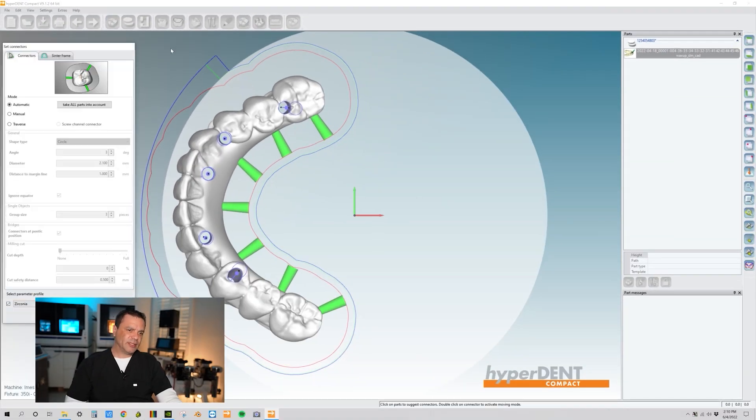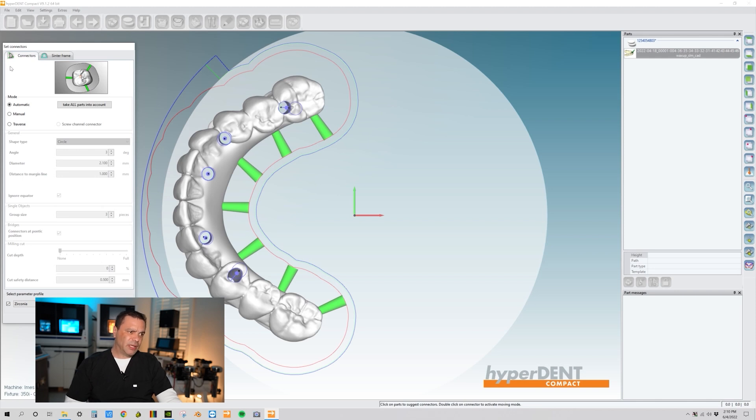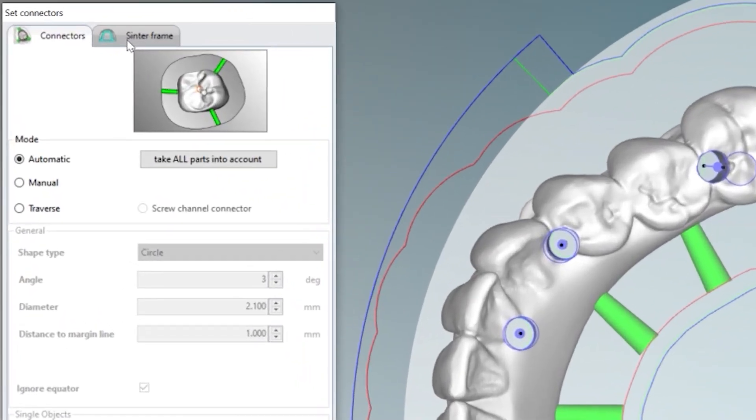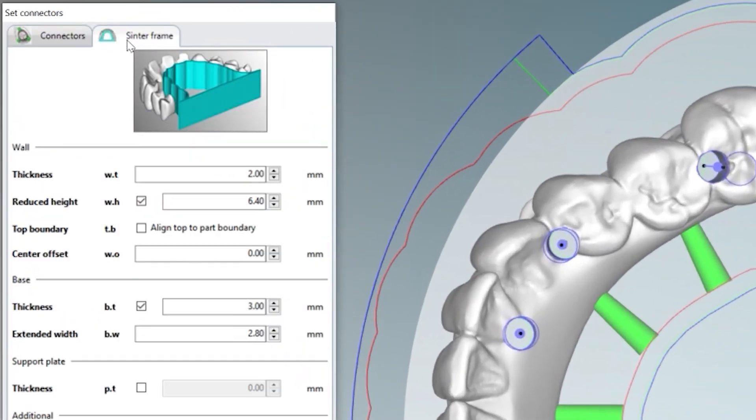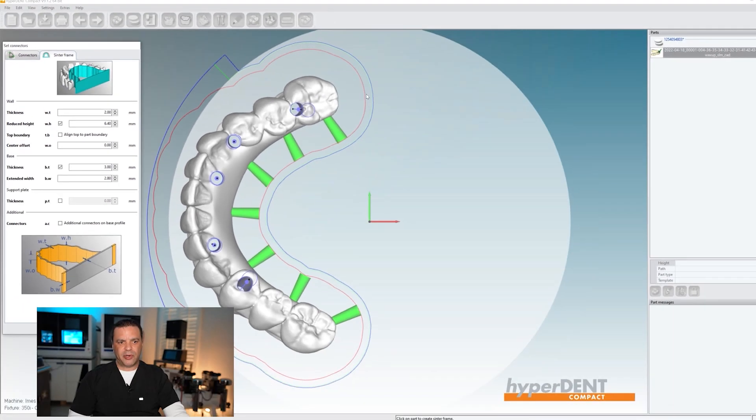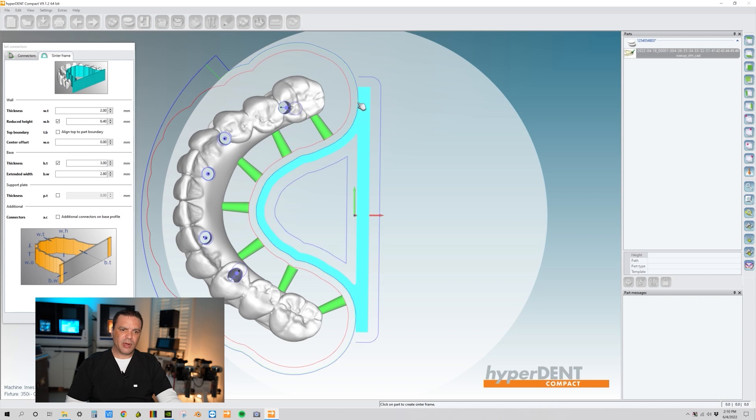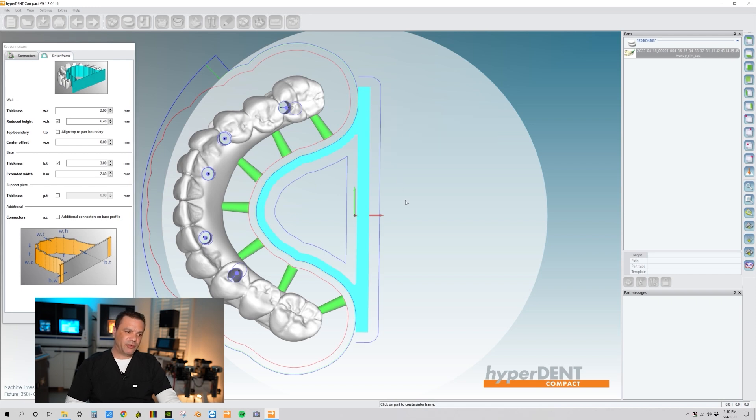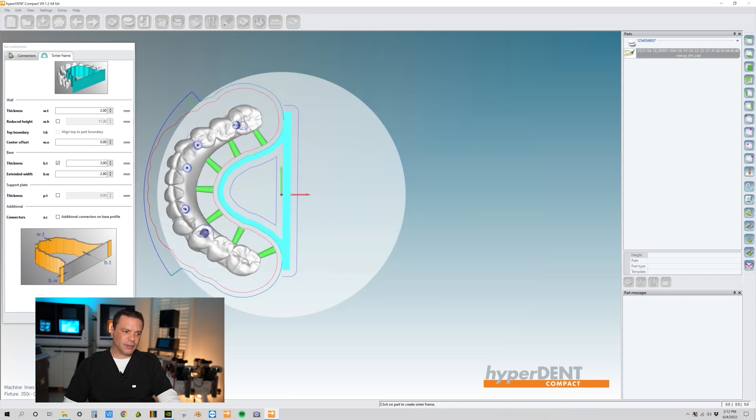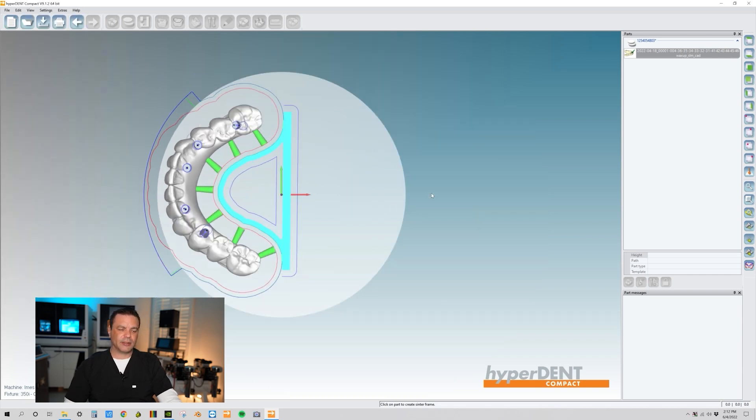All right, so next thing we want to do is we want to set our sinter frame. So to set our sinter frame, just come over here, click on this button, set sinter frame, and then come over here to your boundary border, and then just go ahead and left click. Perfect. So we have our sinter frame set. Let's close off the box.